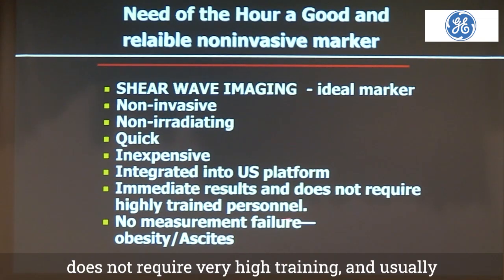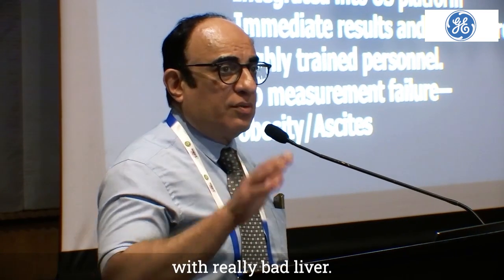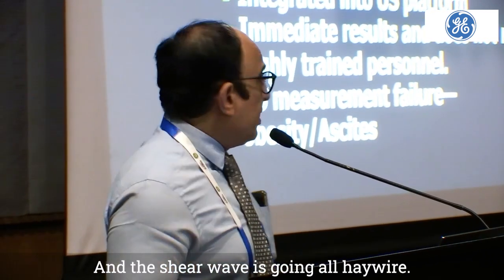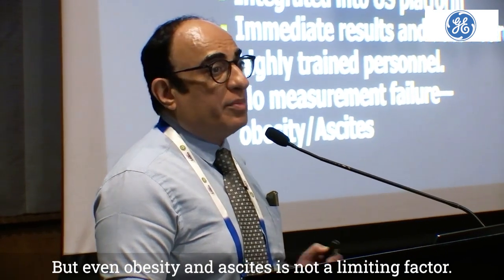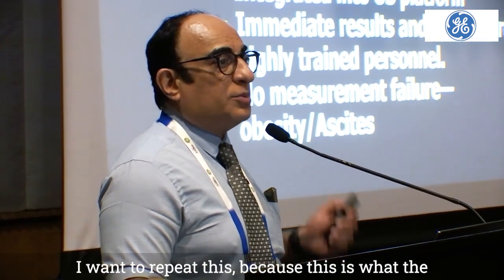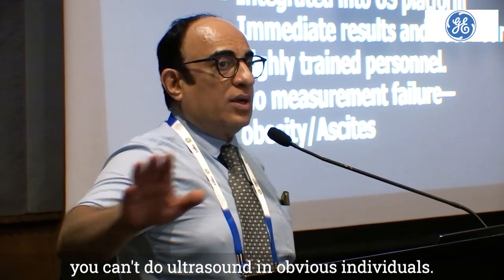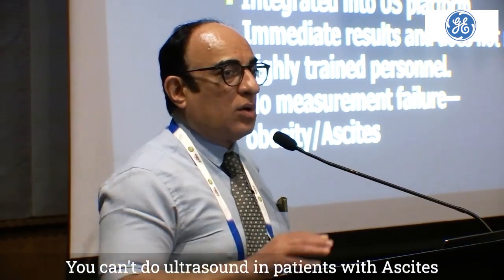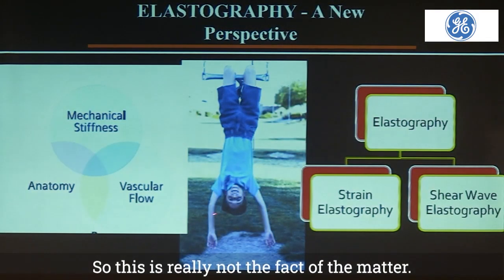It does not require very high training, and usually there is no measurement failure unless you're dealing with really bad liver and the shear wave is going all haywire. But even obesity and ascites is not a limiting factor. I want to repeat this because this is what the hepatologists are saying, that you can't do ultrasound in obese individuals, you can't do ultrasound in patients with ascites. So this is really not the fact of the matter.